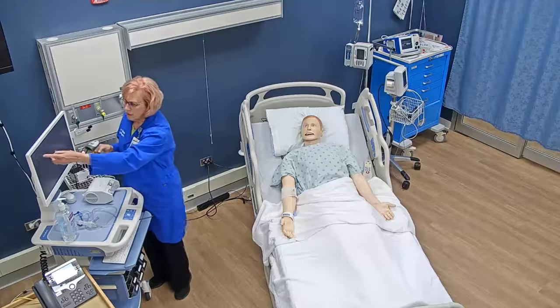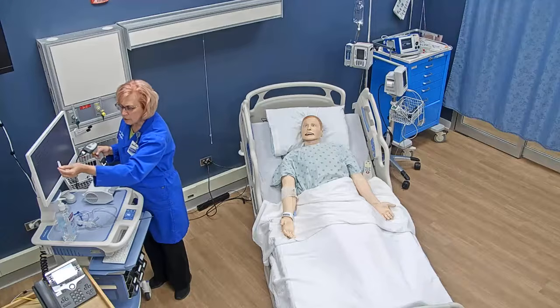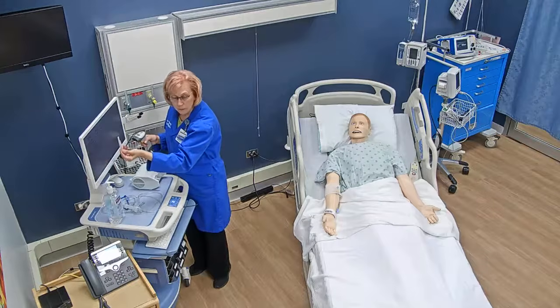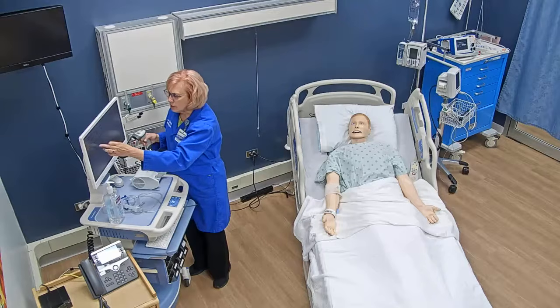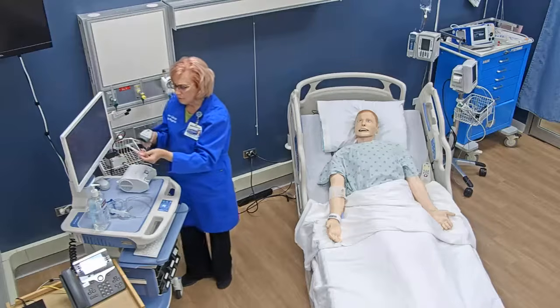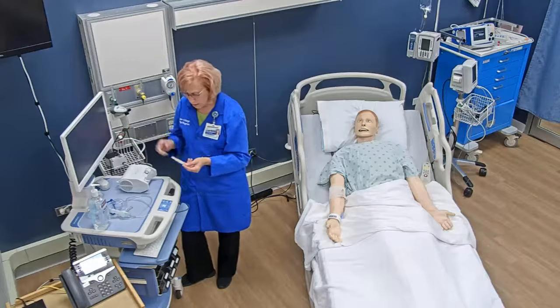So I start with his name, Williams, and the medication that I have is ipratropium bromide and albuterol sulfate. The doses are 0.5 milligrams and 3 milligrams in this 3 milliliter vial. He is going to get this 4 times a day, and right now he's going to get his 9 o'clock dose because it's 9 in the morning. I'm going to scan this medication. So now I have finished my 3rd check and I'm ready to administer the medication.